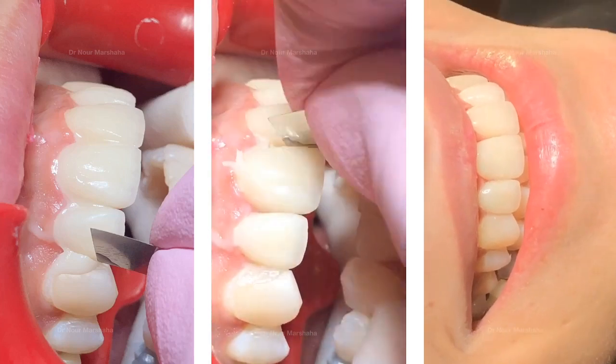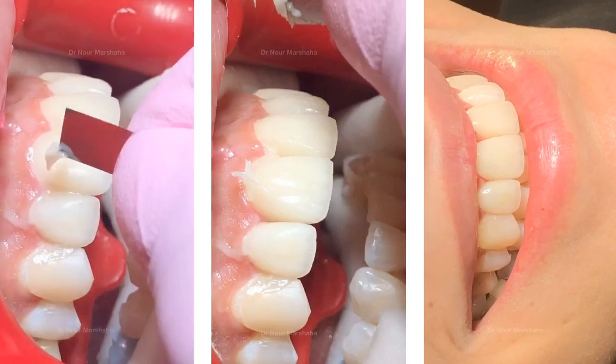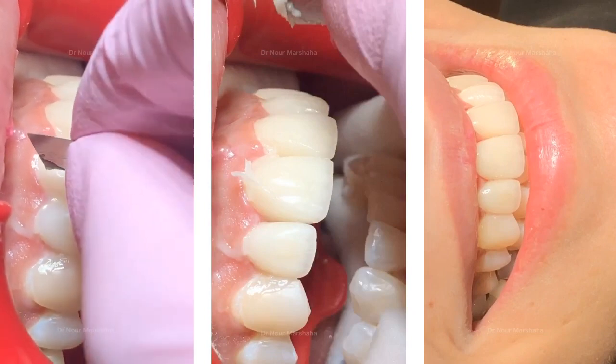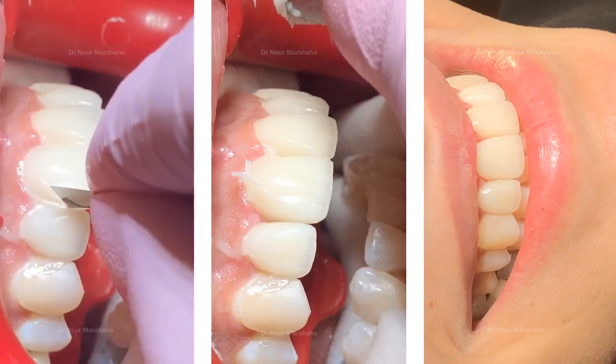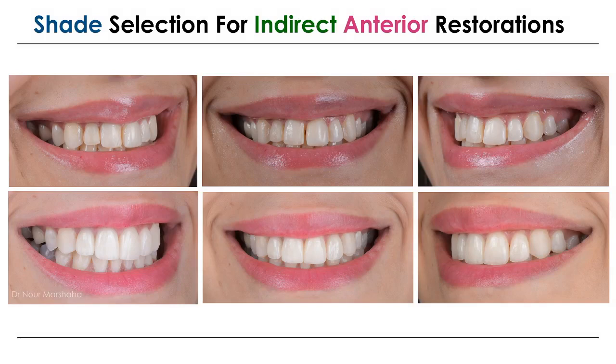While doing the cementation, try to gently remove the cement in a gel phase, okay? Don't try to remove it by handpiece, because it will affect the margin and you will have discoloration later because of the rough margin on the restorations. This is the final result of my patient. Okay, you can see that all the teeth were restored by pressed ceramic, IPS e.max Press restorations, with opaque coping providing the same underlying color effect as the adjacent teeth. It's only for the 4 anteriors, 2 crowns and 2 veneers.